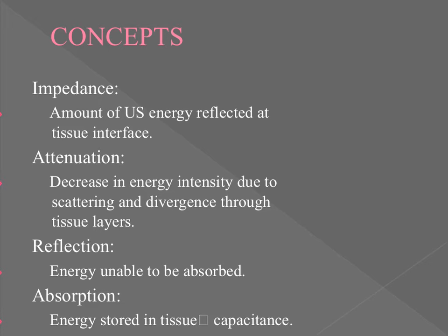And then finally, the ultimate goal of ultrasound is absorption. When you think about absorption, this is what occurs when the tissue collects or absorbs the wave's energy. And then not only that, but it changes it to a kinetic type of energy. Most often that kinetic energy is going to produce heat, right? We get molecular vibration that occurs. That molecular vibration causes a thermal effect. And if that's the goal of the treatment, then yay, kudos.